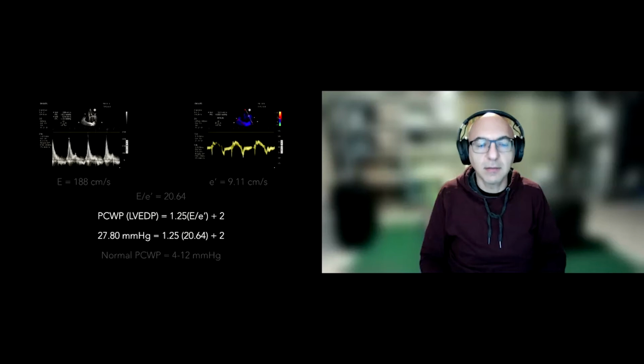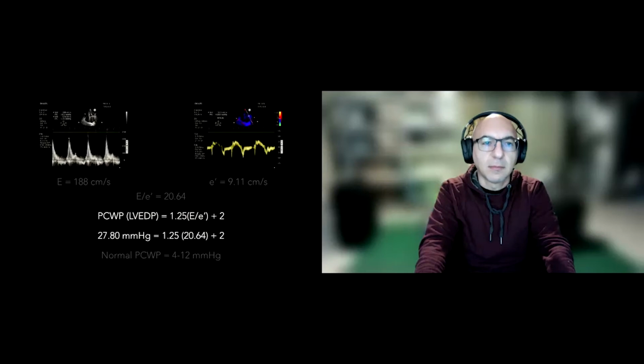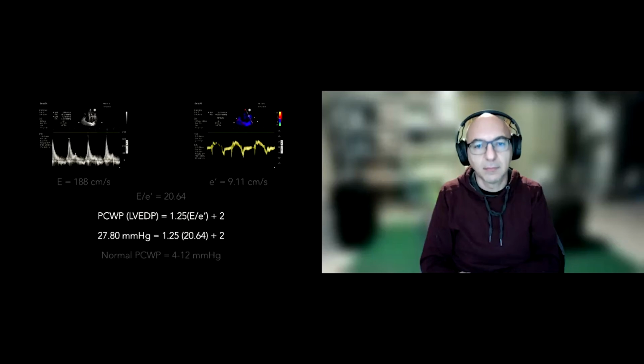Yes, exactly. So to follow that up with what you were saying, that third parameter to diagnose the diastolic dysfunction is the right side of the heart. The question you can think through is: the LV here is not doing so hot. The lung is seeing a high pressure as it's pushing blood out of the lung back into the heart, right? So we're going to have some degree of congestion. We have congestion there in the lung. What is it then doing to the right side of the heart? How far back are we affecting in our cardiopulmonary assessment in this patient?